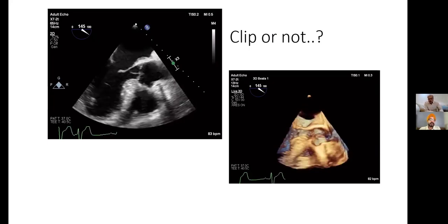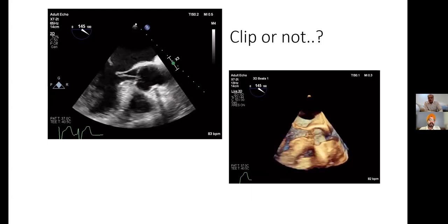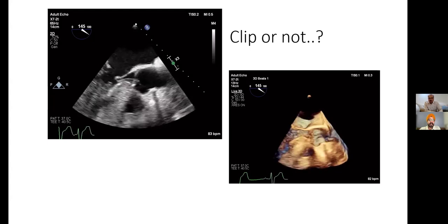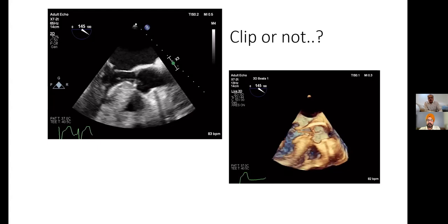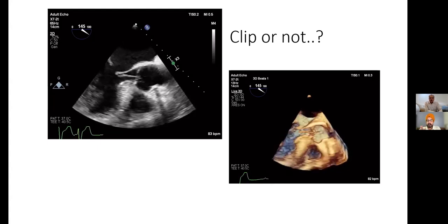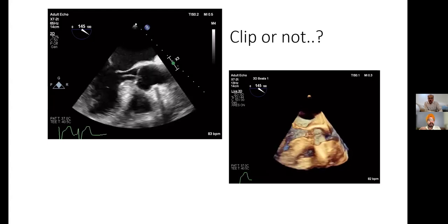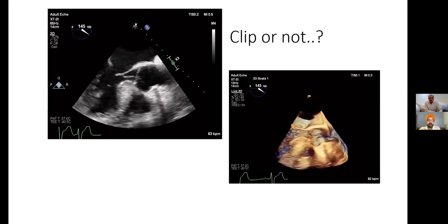So now I see it, it was going in and out of the aortic valve, collapsing right into the aorta and going back. Yeah, correct. It's going in and out of the aorta, going back into the LVOT and LV. In systole, it's going right into the ascending aorta. Absolutely. Wonderful case.